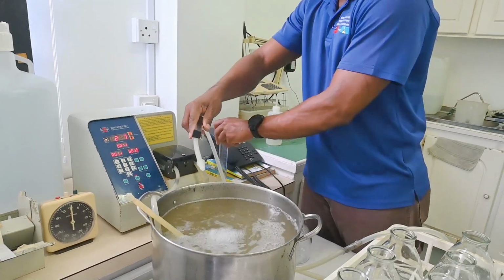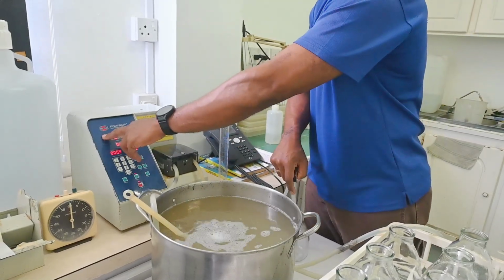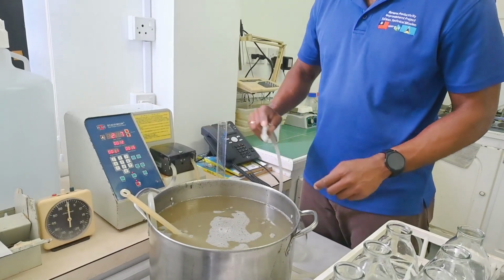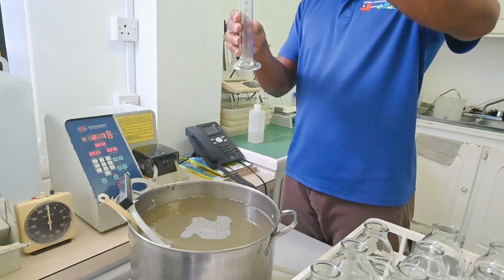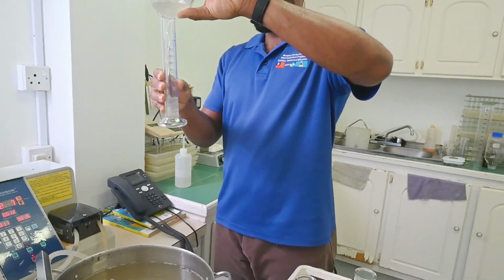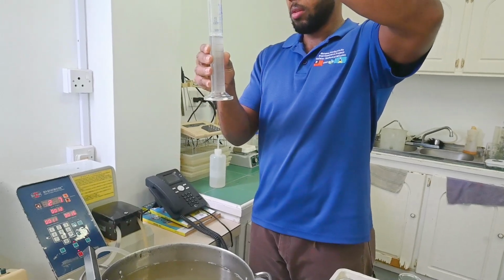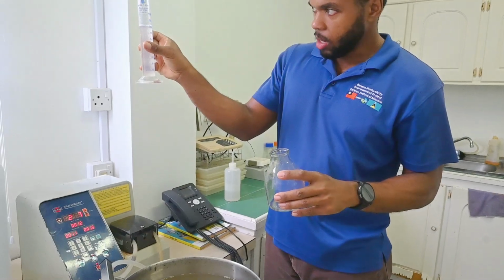And then you run another trial to see. So you always have to check the accuracy of the calibration. Now it's closer to the 80.